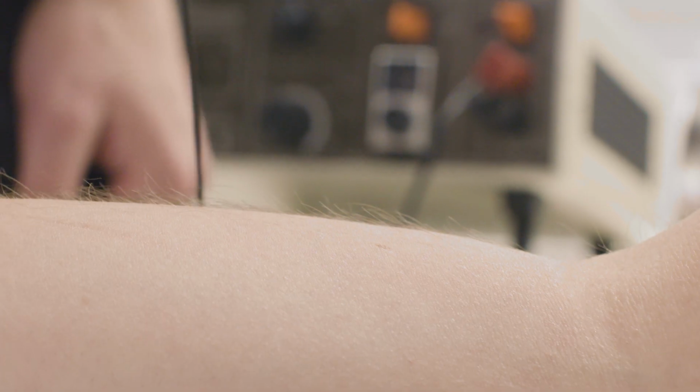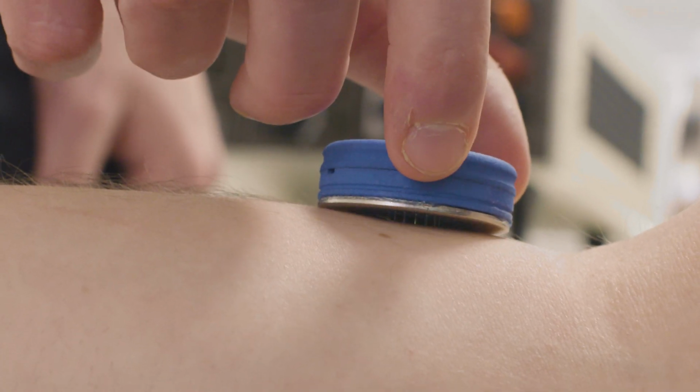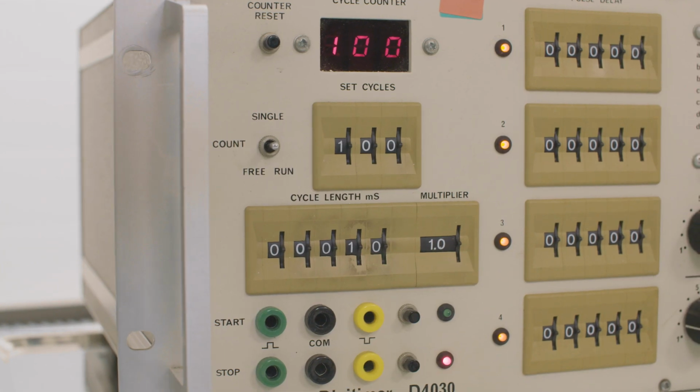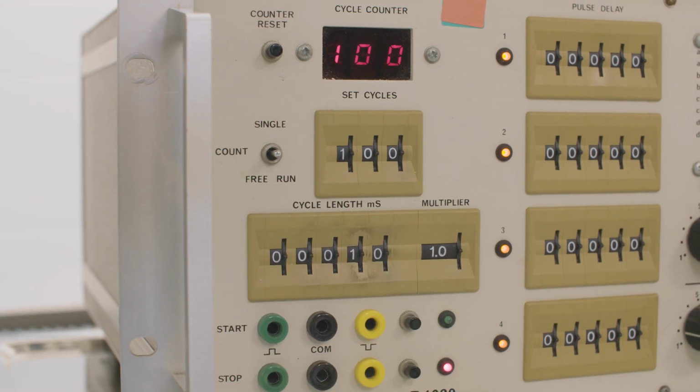So these are the electrodes that we use. To do this, what I'm going to do is ask my participant to put his arm out, and I'm going to place this electrode over the surface of your skin. Now what I'm going to do is deliver a very short burst of stimulation, okay? Okay. And what I would typically do is deliver this 5 times over the course of a minute.